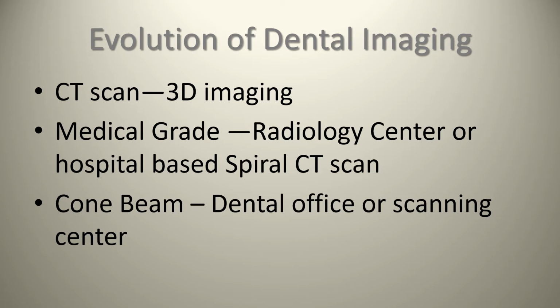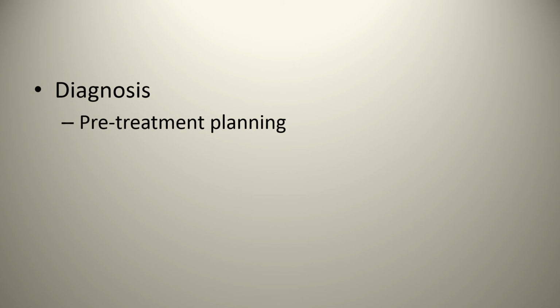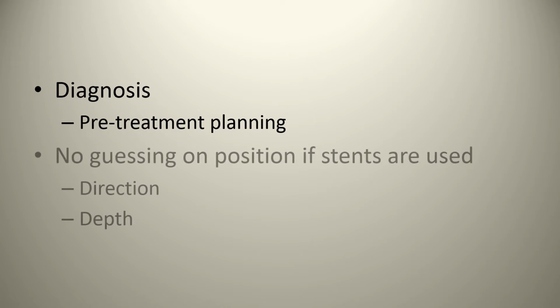Cone beam CT did come onto the market as basically a tool that could be available in a dental office or scanning center, and it would provide us with more capability. So what are these capabilities? Basically, the capabilities you get are from the diagnostic perspective in terms of pre-treatment planning, and one needs to consider, do they require a cone beam CT in this particular case?